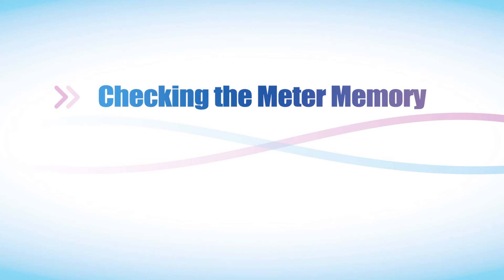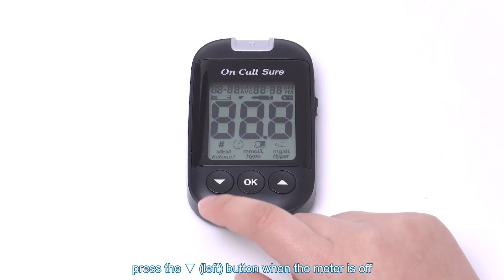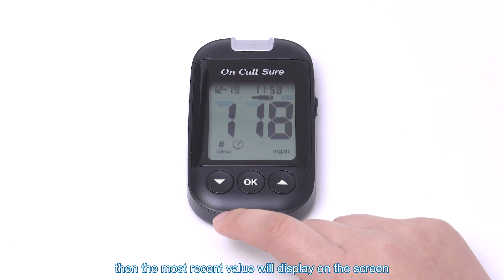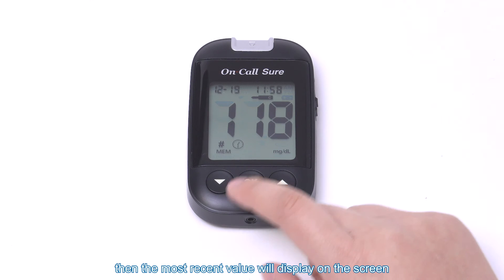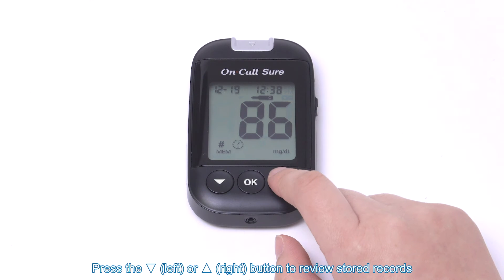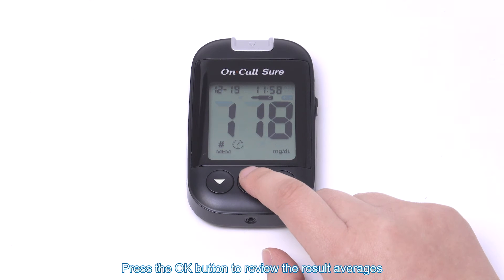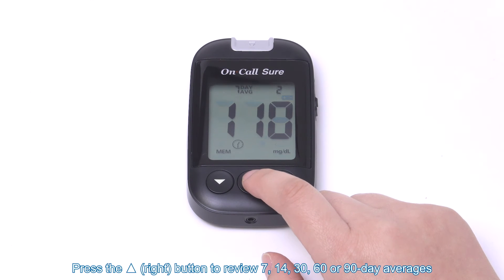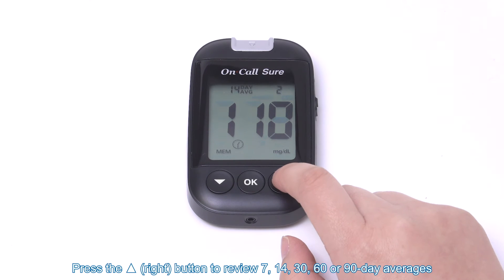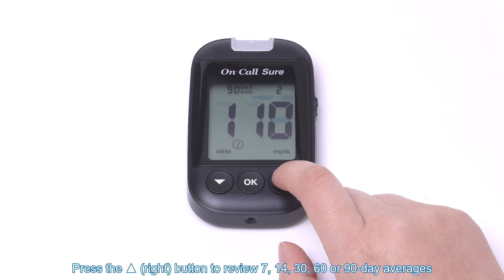Checking the meter memory. To enter memory mode, press the left button when the meter is off. The most recent value will display on the screen. Press the left or right button to review stored records. A hashtag sign indicates the record will be omitted from the average calculations. Press the OK button to review the result averages. Press the right button to review 7, 14, 30, 60, or 90-day averages.